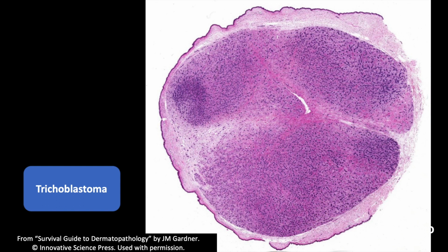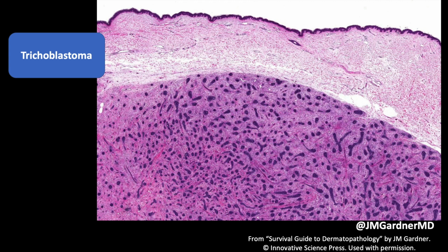So these are times where you might be kind of worried, but look, there's no way this thing's basal cell carcinoma. It's a circumscribed nodule that's not connected or even close really to the epidermis, and it's got its own stroma, even from low power, like 1x magnification. I think this was a digital slide I did, 0.5x magnification. You can see the stroma, it ends right there. It's a very sharp cutoff from the surrounding background dermis.